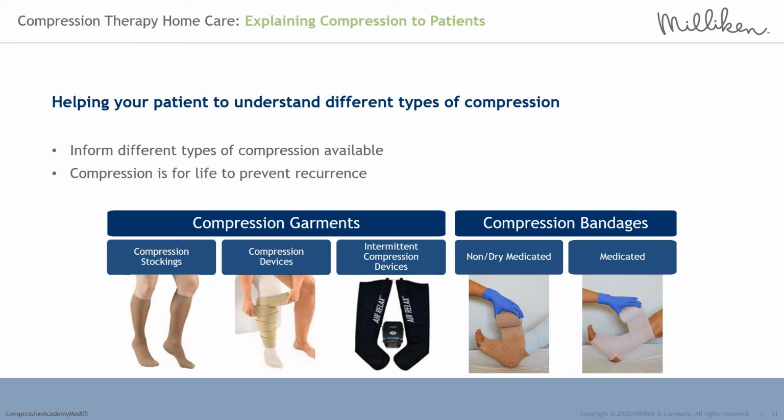Compression bandages. These are considered gold standard and usually first-line treatment. There are many different types available and the practitioner will select the best one to meet the clinical and individual patient needs.